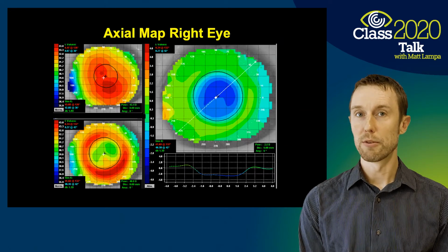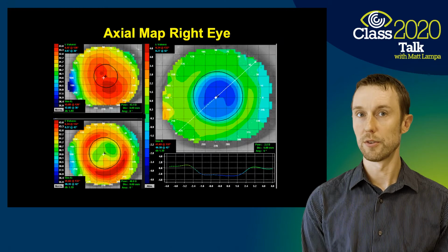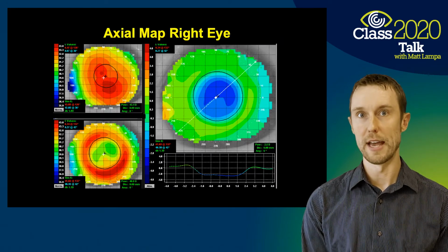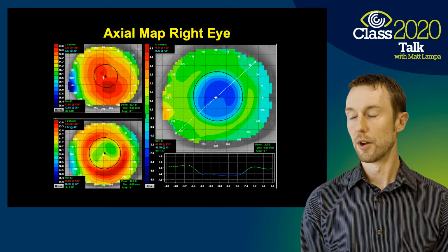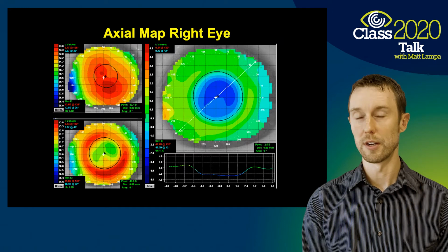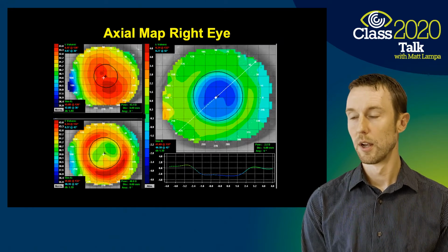The axial display really has its utility in corneal topography in orthokeratology for the power. The axial display is really just that. It's a description of the corneal topography in terms of its power. It gives us the prediction of vision, how well a patient is predicted to see based off of their corneal topography.